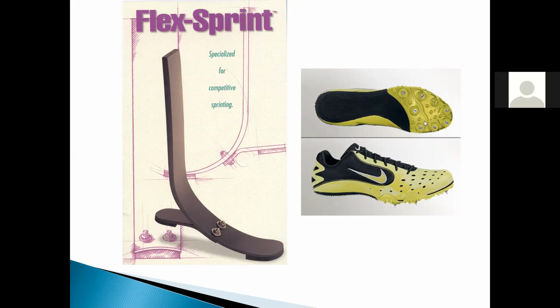Okay, and as you see, for people who had experienced these, they have really no heel. Because what you want to do with sprinting is really a forefoot strike. And the reason it's a forefoot strike is then you can really benefit from all the bending and energy return of these biological springs in your foot and ankle. The midfoot spring is bending and energy return.